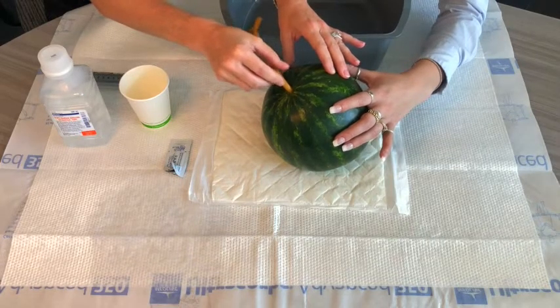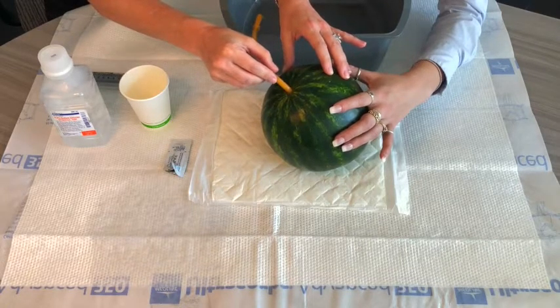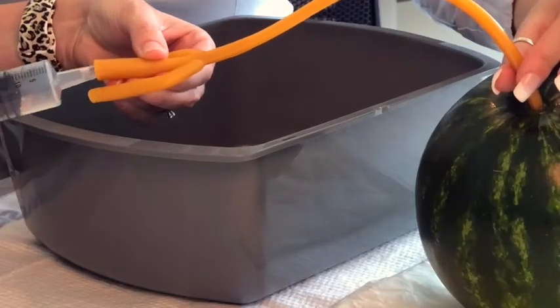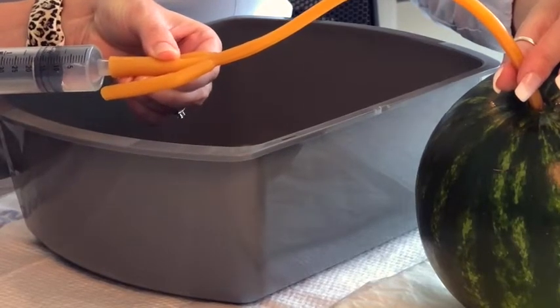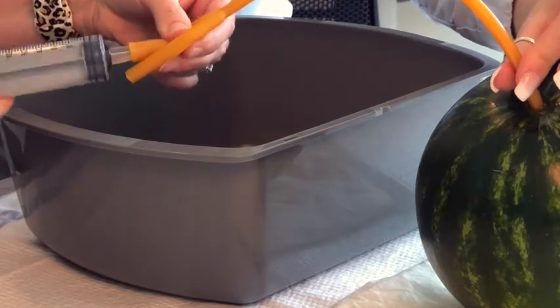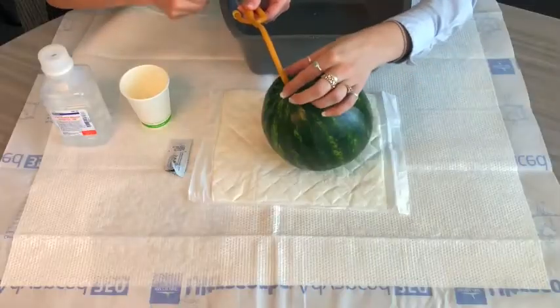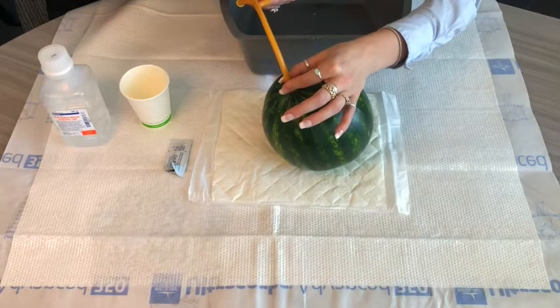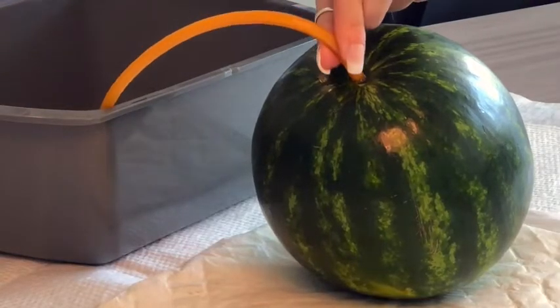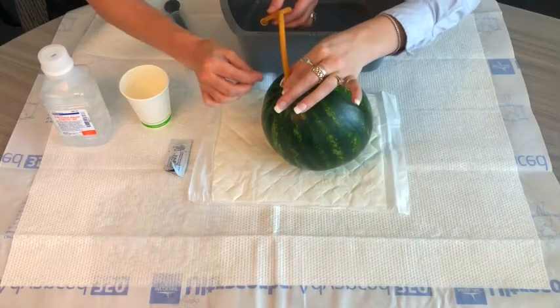Continue advancing your catheter until you meet resistance. You'll continue to have pockets of water and/or air that drain out into your basin. Once you've stopped draining, grab your syringe and attach it to the end of your catheter. Start inserting the saline in about 10 to 20 milliliters. Then hold on to the catheter, disconnect the syringe, and use an in-and-out motion — advancing and removing the catheter — to get different pockets of air and stool to come out.